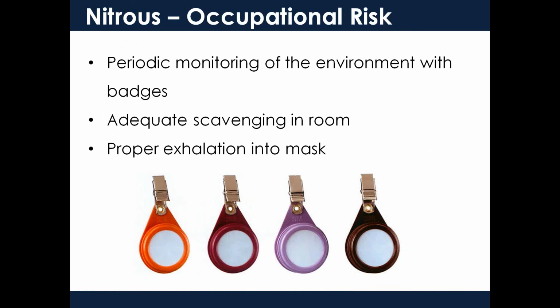We have a large face mask. So the patients will just leave it on their face, take a big breath in, and then exhale through it. If they pull the mask away and exhale into the room, we're right on them. We're like, you really need to exhale into this. We give them the education. Why is that so important, that you're doing it accurately?